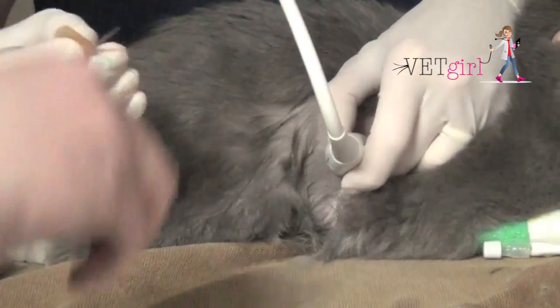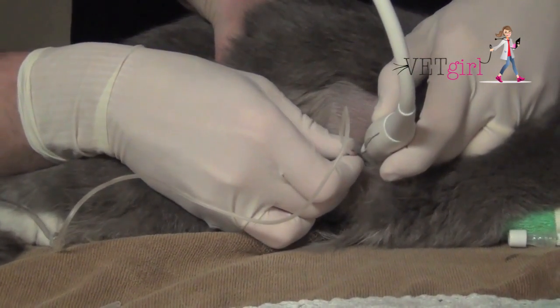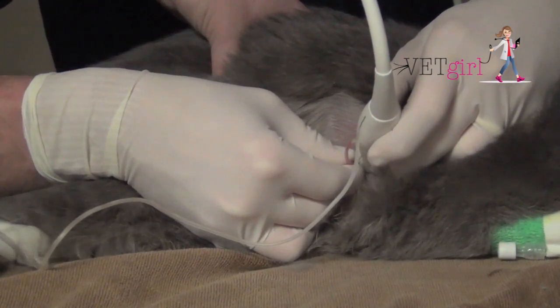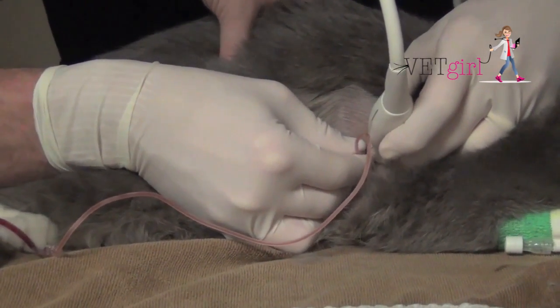We typically want to go in the 7th to 9th intercostal space, ideally cranial to the rib to avoid the vessels and the nerves, and evacuate as much pleural effusion as we can to make the cat comfortable.